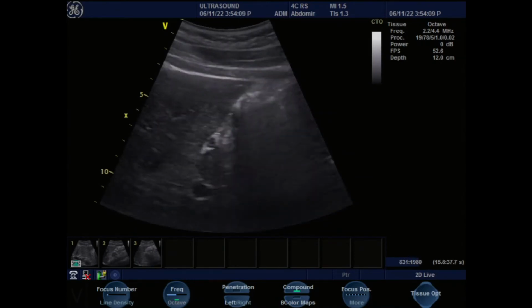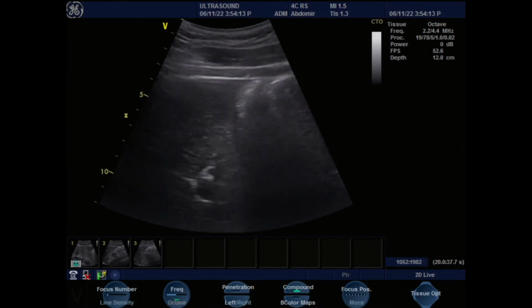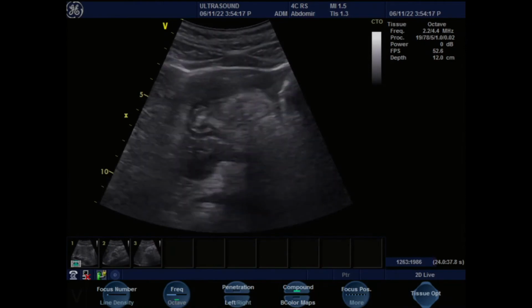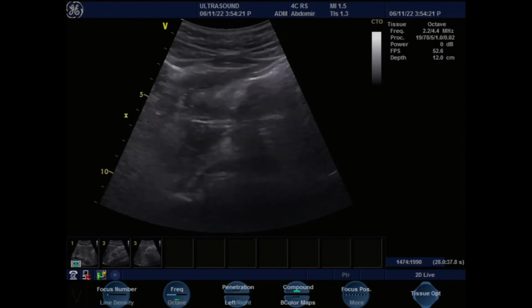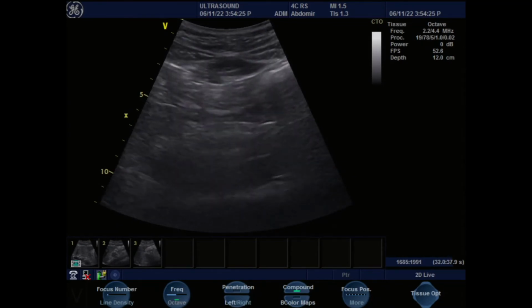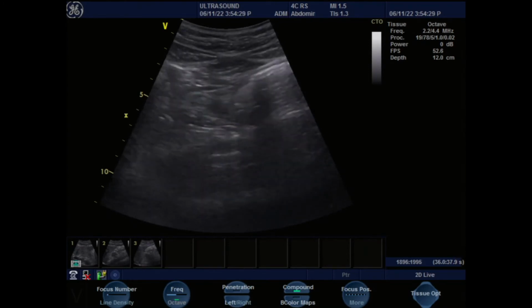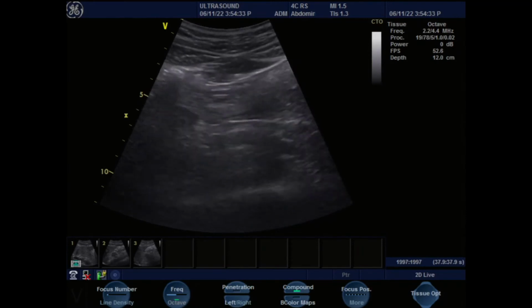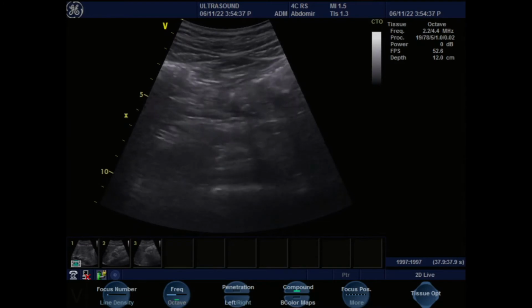But that's only with the sagittal, right? For both. For transverse too. Transverse would be right to left. So the only difference is the anterior and posterior is still the same, because the sound wave is going from here to the bottom. So the skin and the back is the same, but now our orientation would be right and left.